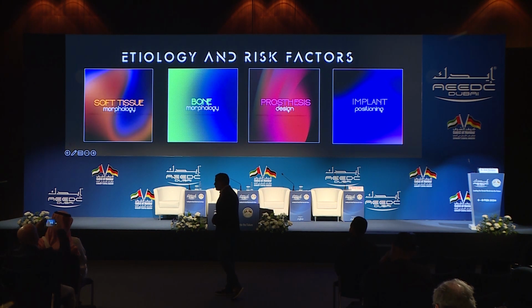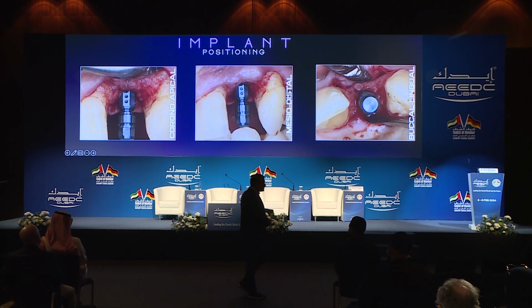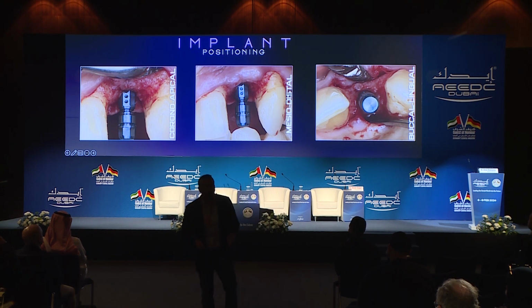The number 4 pillar for implant dentistry is implant positioning, which I will be talking about. And today we have guidelines. When I started doing implant dentistry back in 1999, we did not have any guidelines for implants in the aesthetic zone. We were placing the implant where the bone was. But today we know where the safest zone is to place these implants in an ideal 3D position. So we get to the second point now, the etiology.